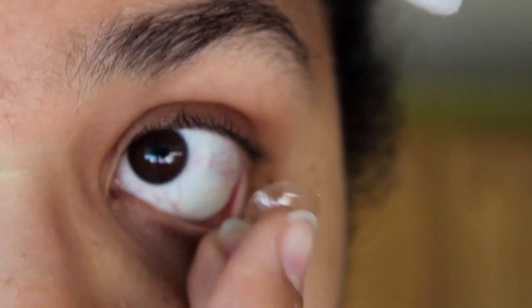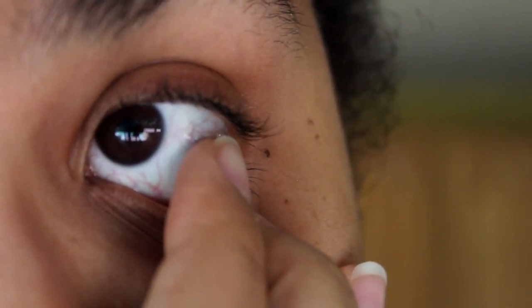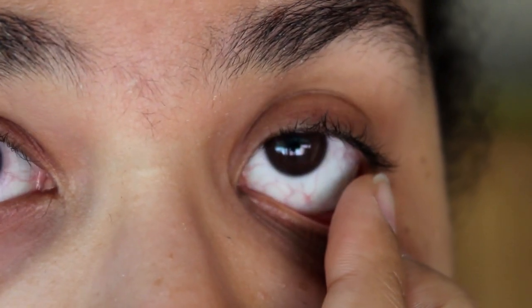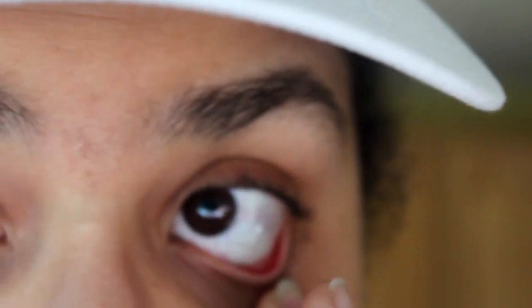Now that I can kind of see a little bit, let's try putting the other one on. Hopefully I won't have as much trouble. What I like to do, once it's on, is give it a gentle press to get all the air bubbles out of the contact, and that helps it stick to my eye.